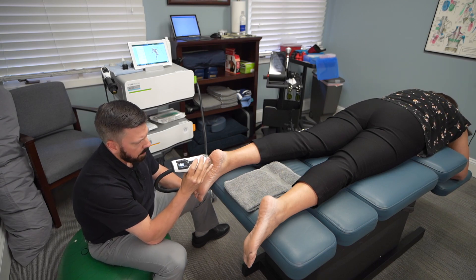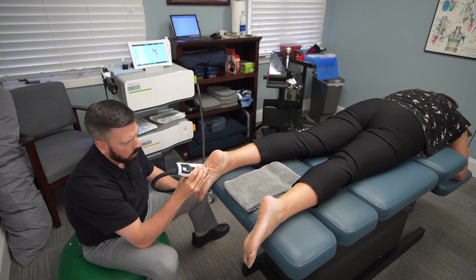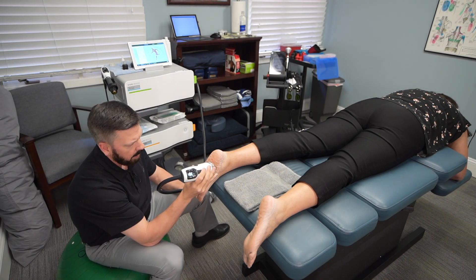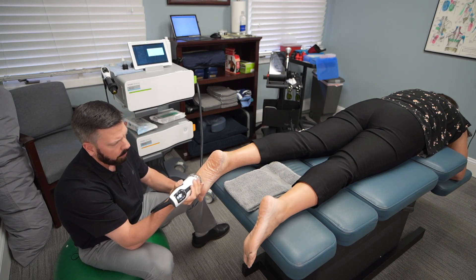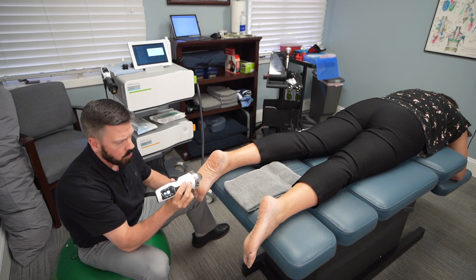Depending on how acute or chronic the condition is, a lot of times people who suffer chronically are in so much pain and discomfort day-to-day that when we do the treatment it's not uncomfortable at all and they actually feel quite a bit of relief right through that area. This is the focus shockwave treatment we're using on her plantar fascia.